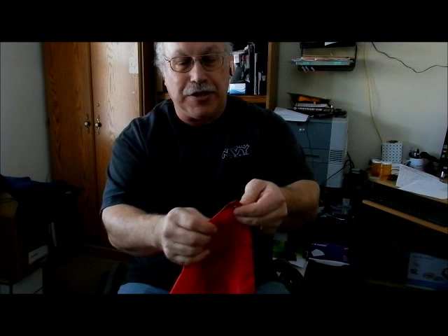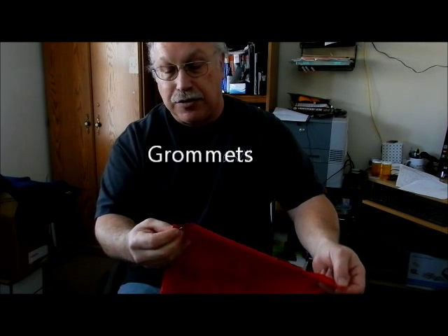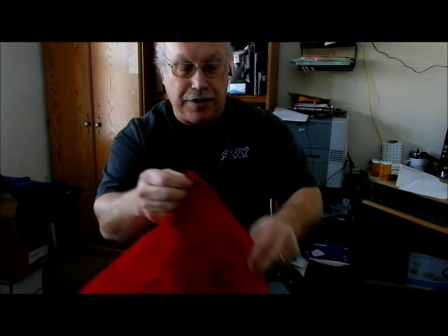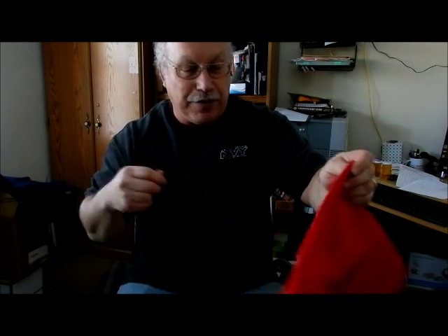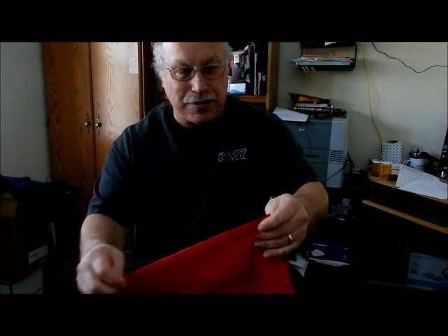Now you see there's grommets here. And this one's about to come out, and so is this one. So I have some grommets that actually are identical to these. I'm going to put one on this side. You've got to pull the strings all the way out. It was fun rethreading this for this video. And we're going to put grommets on this side and this side. So we have grommets on all four corners now.